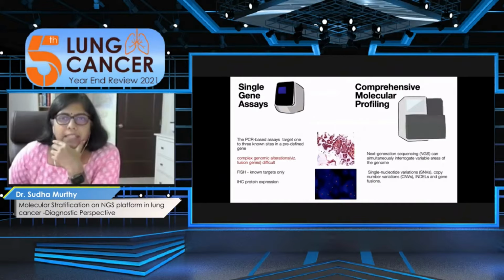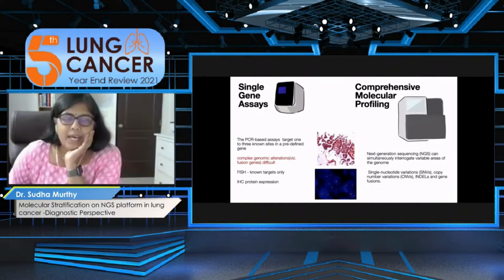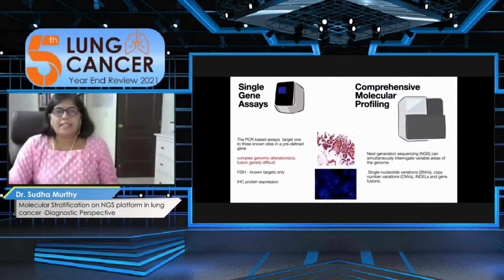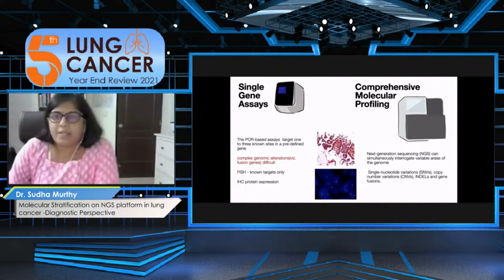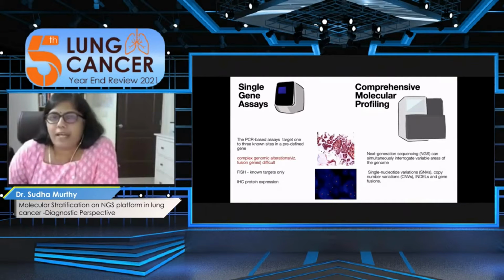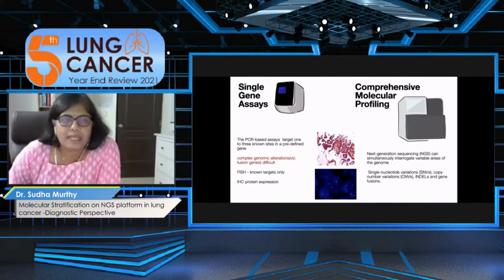So, single gene assays versus comprehensive molecular profiling. We know that comprehensive molecular profiling is now preferred because PCR based assays would look at specified targets and we would not know the unknown targets. And with so many actionable targets that have been identified in recent times, it becomes pertinent to understand that comprehensive molecular profiling has been recommended by all guidelines wherever feasible. Despite that, my colleagues have discussed all the challenges.